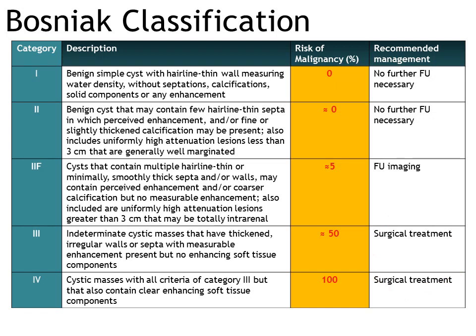I think more important thing is a common understanding among the reporting radiologists and the referring physicians regarding the risk of malignancy. There have been a lot of articles on this issue, but roughly we may say that the risk is 0% for Class 1, almost 0% for Class 2, about 5% for Class 2F, approximately 50% for Class 3, and 100% for Class 4.